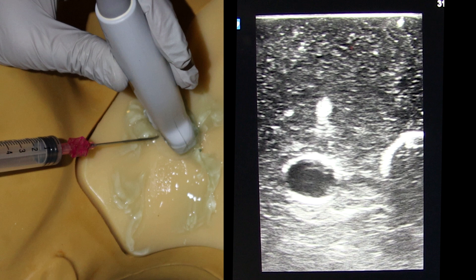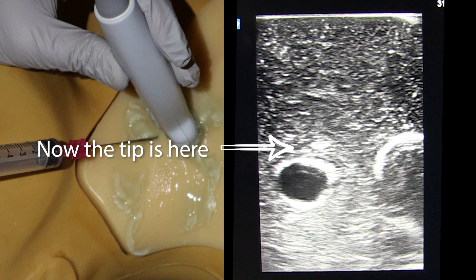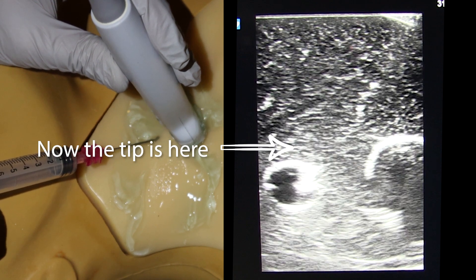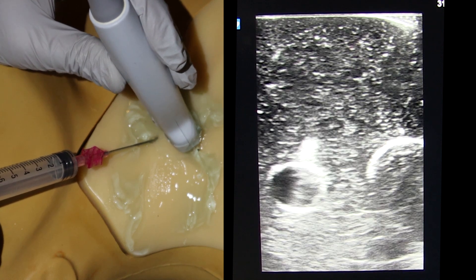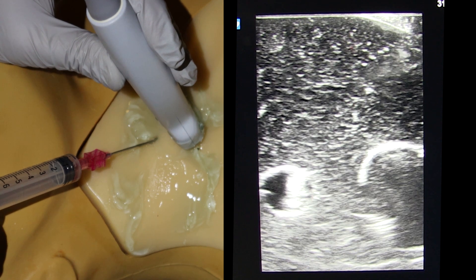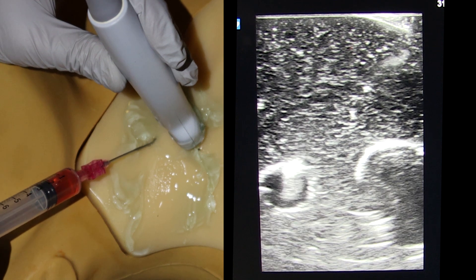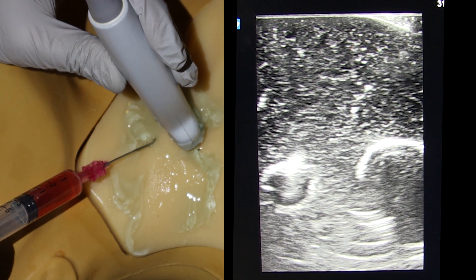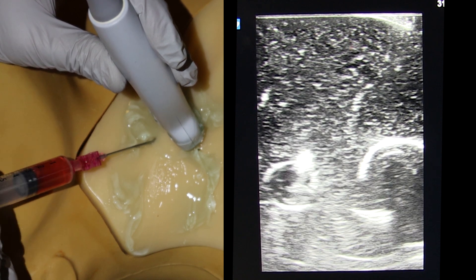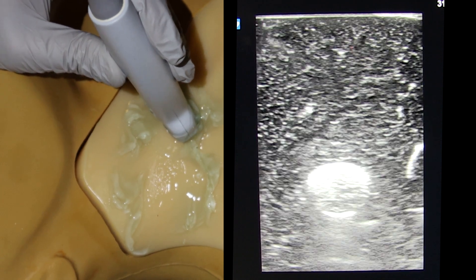Advance the needle a little bit, then stop, then move the ultrasound further until you reach the spot just where the needle disappears, and repeat these two steps as you continue advancing the needle and watching the tip move toward the vessel. Along the way you may need to change course left or right to remain on target. I definitively saw the tip enter the vessel, advanced no further, pulled back, and got blood. This method may seem cumbersome, but once you get used to it the movements are like a coordinated dance — and I like it because you always know where the tip of the needle is.